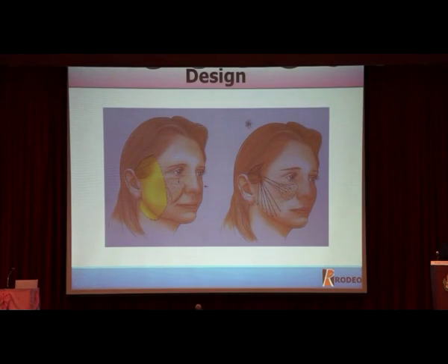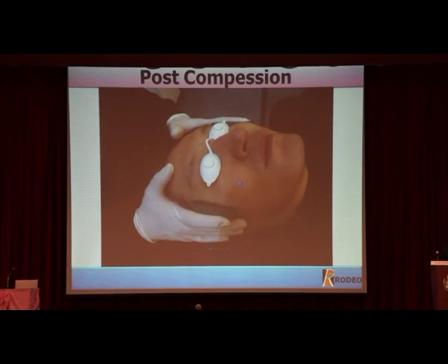There is a design. The old design was the hairline, but the modified design is a hairline area. You decide the insertion points in the hairline area. At this point, 1, 2, 3, 4, 5 insertion areas. And you prevent complications with post-compression. Post-compression prevents complications.